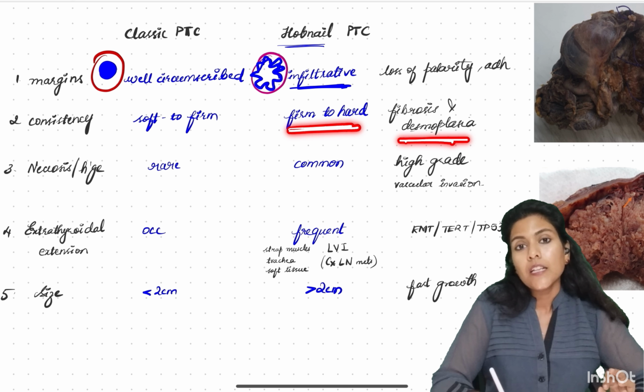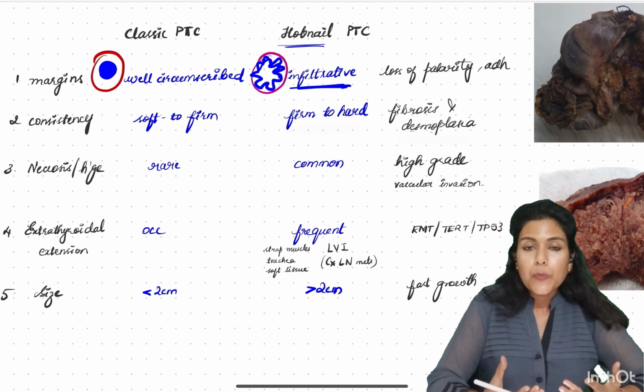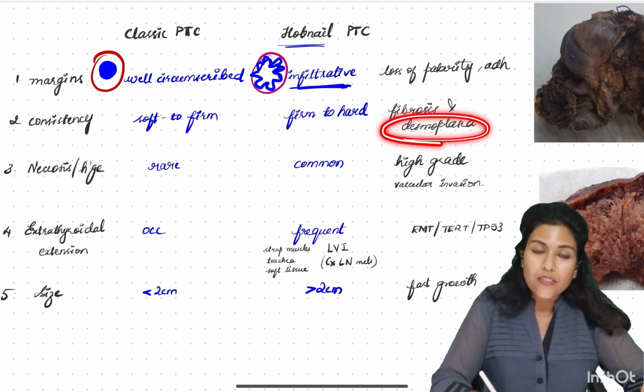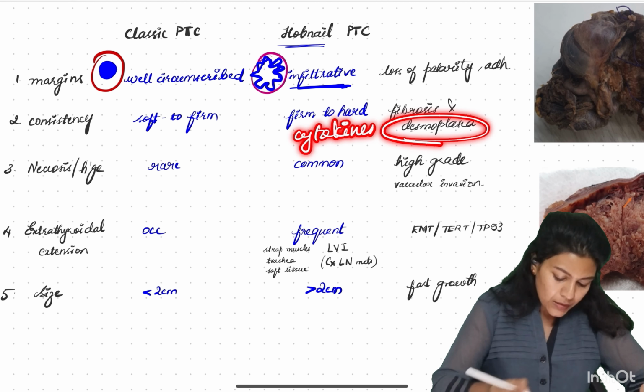The tumor cells grow at a faster rate and invade the surrounding stroma. The stroma responds by depositing more fibrocollagenous tissue. This increase in fibrosis is called desmoplasia, because of the cytokines released by the tumor cells.